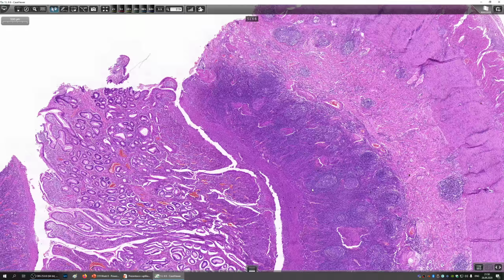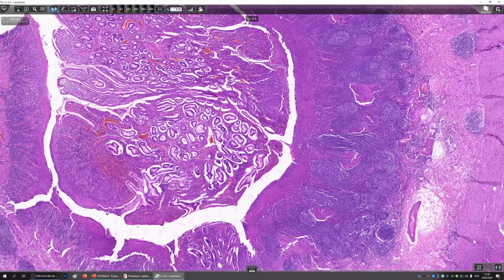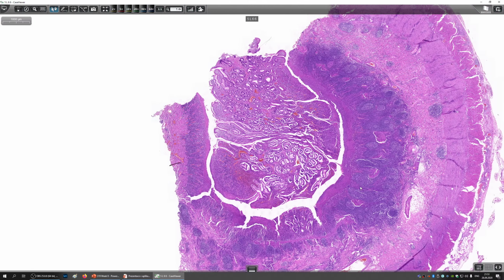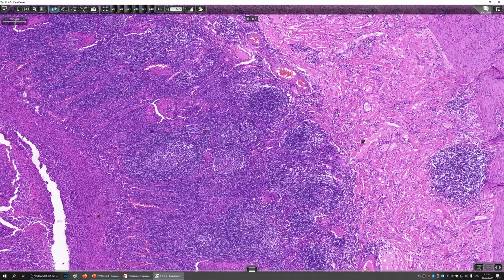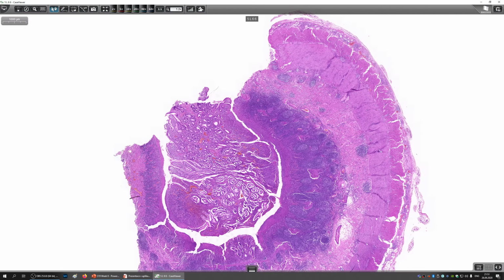So this ulceration happened above mucosa-associated lymphoid tissue or MALT. So in this case, it could be called aphthous ulcer. Aphthous, A-P-H-T-H-O-U-S, aphthous ulcer. This usually happens in the distal ileum. And here we can probably guess that a hyperplastic mucosa and the chronic scarring, here you can see it's quite scarred, and a lot of lymphoid infiltrate has caused the stenosis of the lumen.